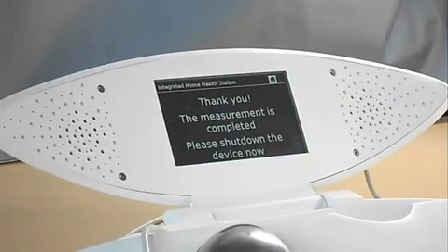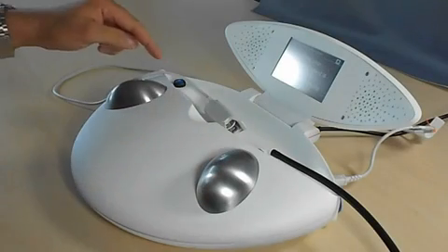The measurement process is finished. Thank you very much. You can now switch off your device.